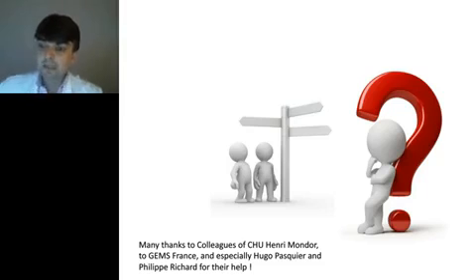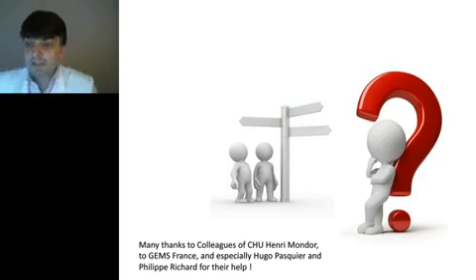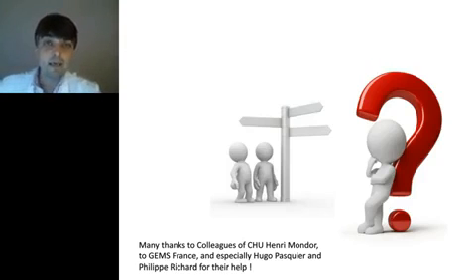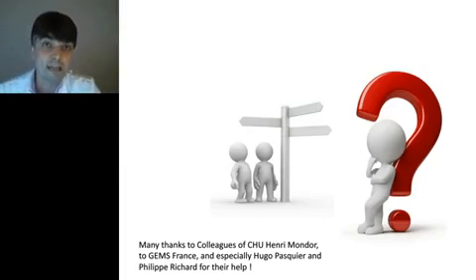Okay, first question is, can you use spectral imaging using the same temporal resolution as you used in polychromatic images? Well, actually, that's correct. One way to answer that is, what is the timing of the acquisition? Well, the timing of the acquisition is based on the rotation speed and the pitch. So if your system, which is the case with the HD750, is able to compute a 0.6 second rotation for every rotation, and you can have the same pitch that you use, well, there you go. You can have exactly the same temporal resolution.